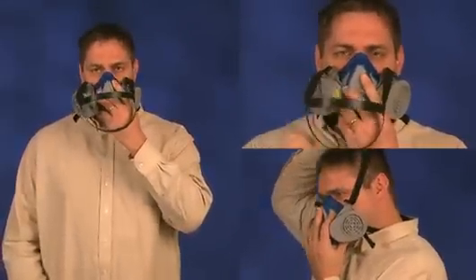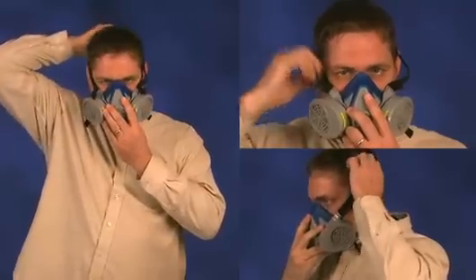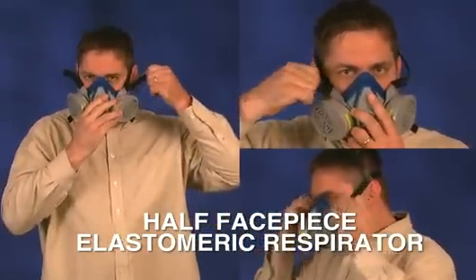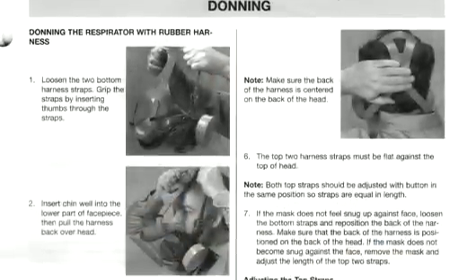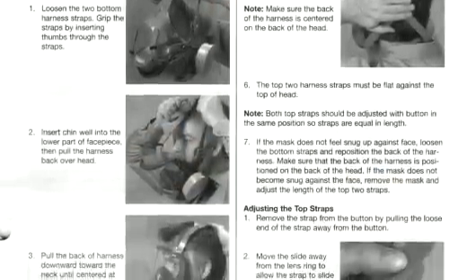Now let's explore the general instructions for properly donning and doffing and properly conducting a user seal check for a half face piece elastomeric respirator, sometimes referred to as a half mask. Remember, these are just general instructions. You should always follow the manufacturer's instructions for the specific respirator model that you are using.